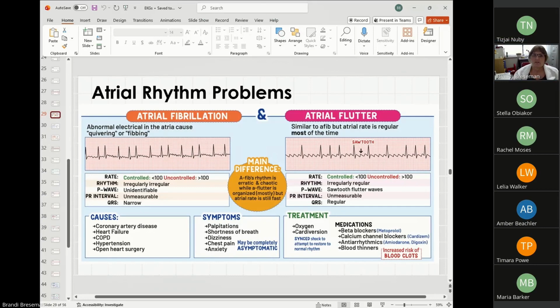Okay. So if we look at these right here, you will see this is atrial fibrillation, and see how this one and this one are really close together, right? And then these 2 are really far apart. And then these are maybe a little closer, and then these are really close again, and then these are really far apart.